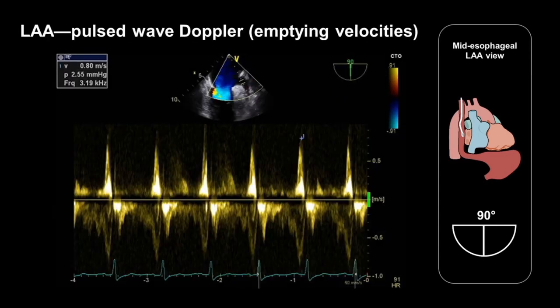We should also perform pulsed wave Doppler to measure the emptying velocities of the appendage. To do this, place the pulsed wave Doppler sample volume approximately one centimetre inside the orifice of the appendage. In this case the emptying velocity is 0.8 metres per second. Low appendage emptying velocities below 0.2 metres per second are associated with an increased risk of thrombus and embolism, whereas normal emptying velocities greater than 0.4 metres per second indicate a higher chance of sustaining sinus rhythm after cardioversion for atrial fibrillation.